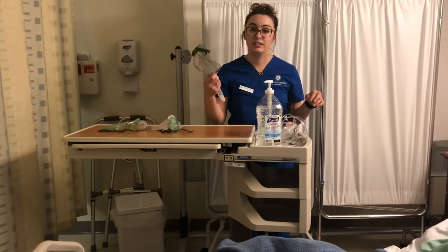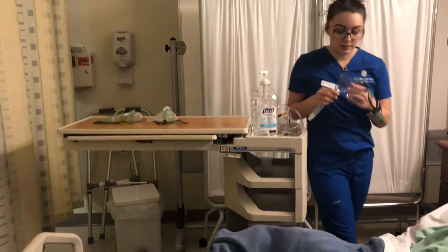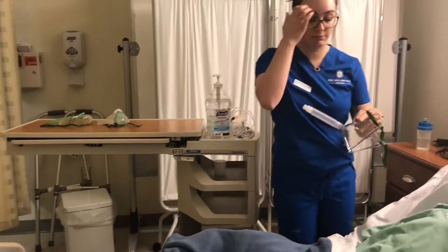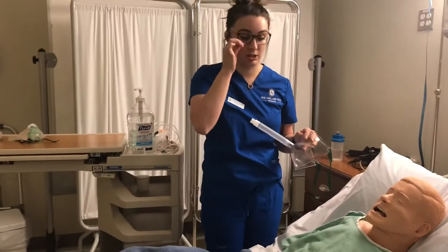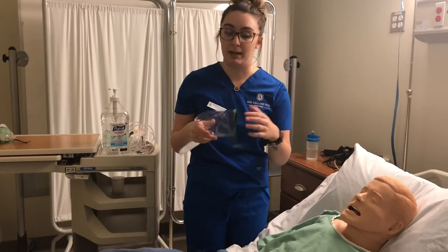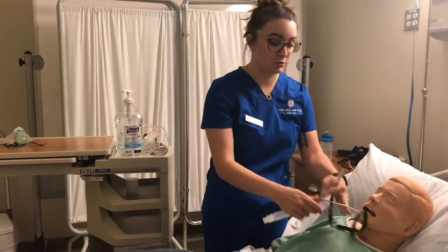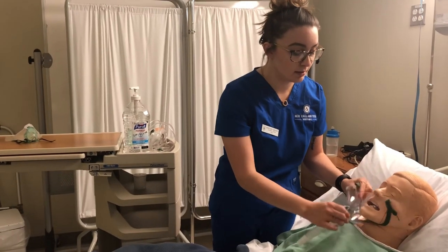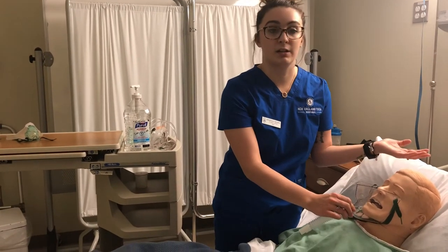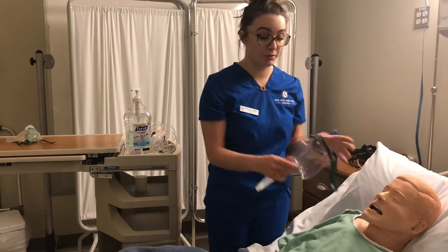Next, I'm going to show a face tent. A face tent, rather than being a standard mask, goes right underneath the chin and sends oxygen into the patient's nose and mouth.